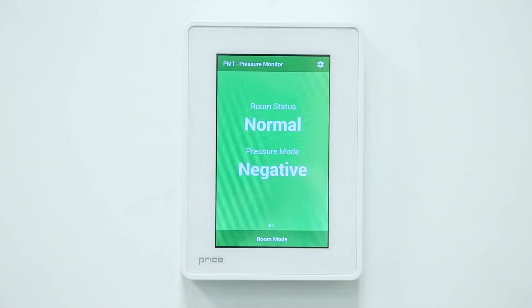The PMT allows for room pressure monitoring with a simple and easy to use interface. For more information on the PMT or our other products, please visit AntechControls.com.